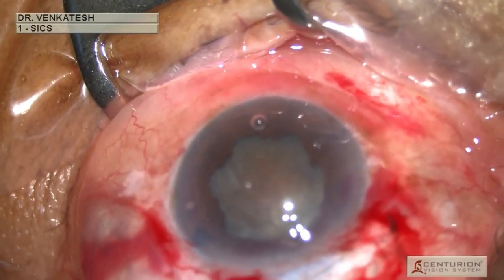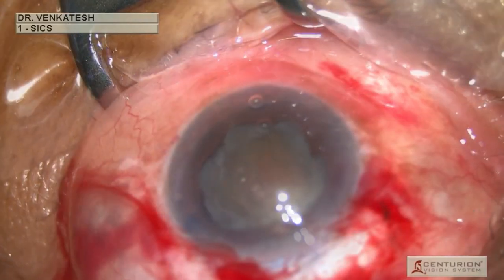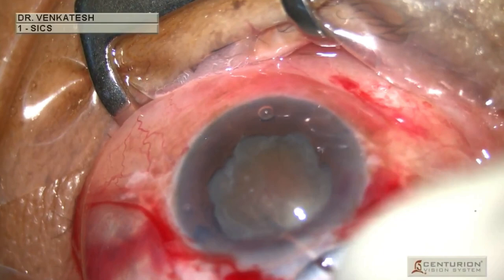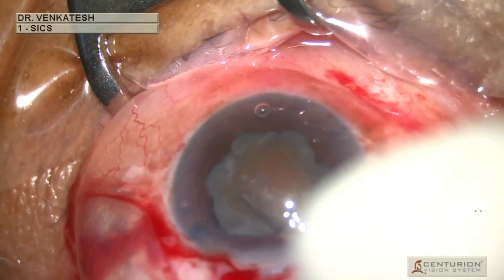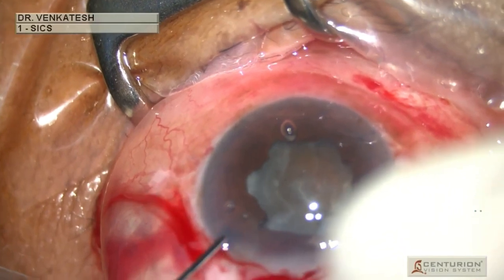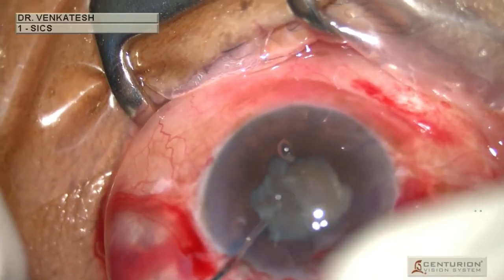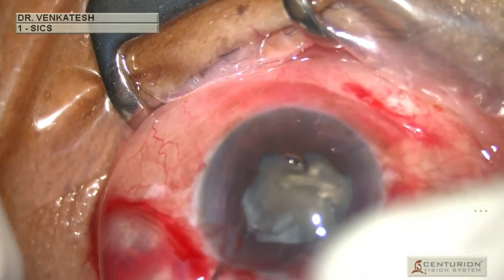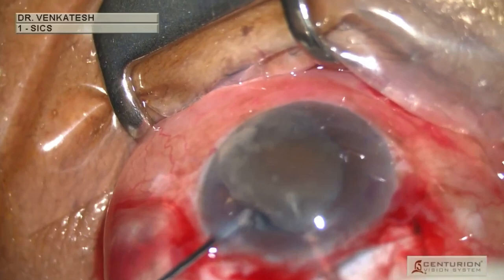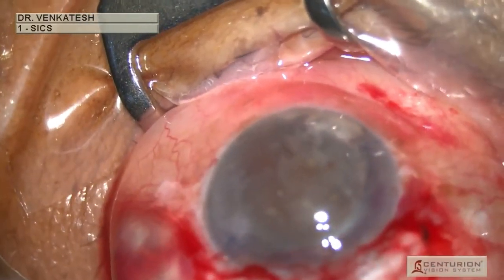As the nucleus is very large, a bimanual nuclear prolapse is performed. First, with the Sinski hook, the nucleus is held firmly at the mid-periphery and tilted towards the nasal side. Then a spatula is passed through the left-sided paracentesis and underneath the nuclear equator. The edge of the nucleus is then lifted, and the Sinski hook is used to dial the rest of the nucleus into the anterior chamber.